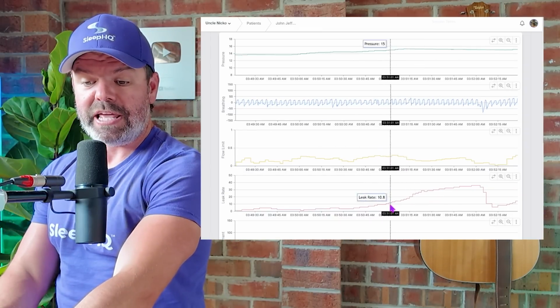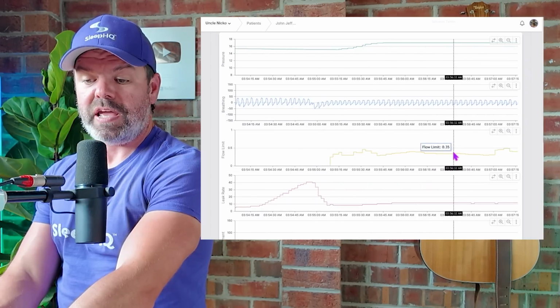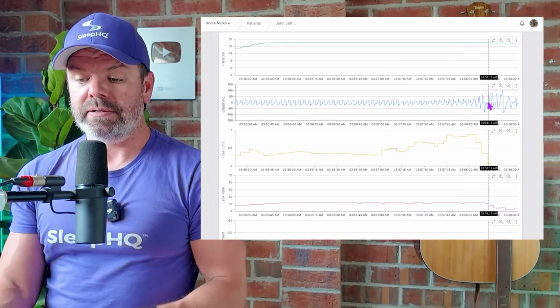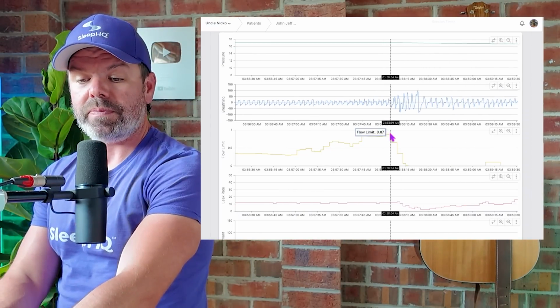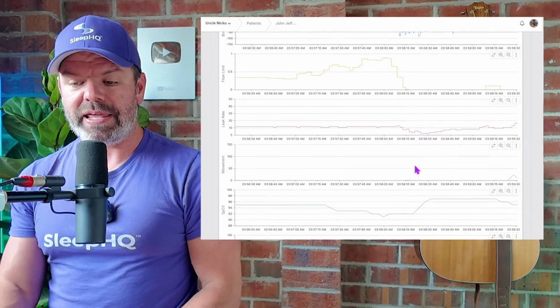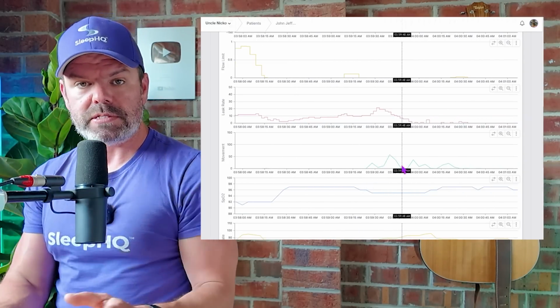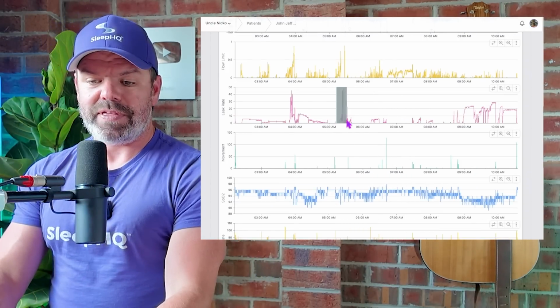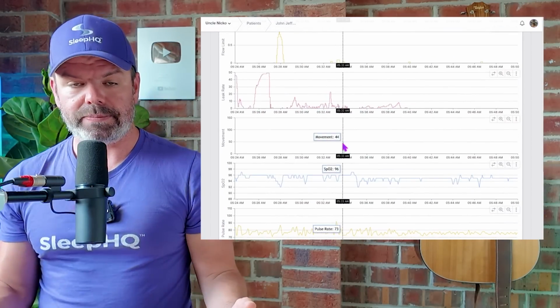Look at this. Look at the leak rate go up. Look at it go up. And then look at this. Look at the airflow limitation. Whoa, it's up here at 0.82. And at this point here, he wakes up. All right, you can tell he wakes up because the flow limitation drops off to 0. You don't have flow limitation when you're awake. And if we come down here, what we can also see is movement. This is him moving because he's woken up. And here's another one here. Same thing again. Pressure jumps up, leak jumps up, movement wakes up.